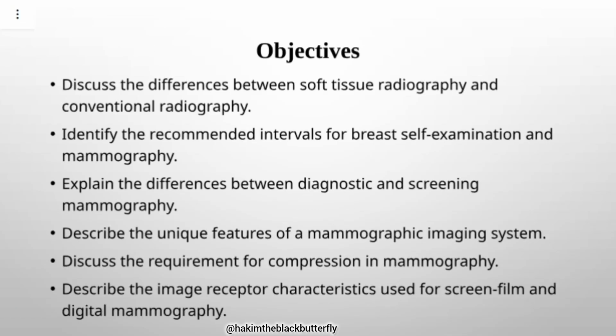For scanning women's breasts, it is a modality which is superior to other modalities in detecting breast cancer at a very early stage, because it is able to even detect microcalcifications.